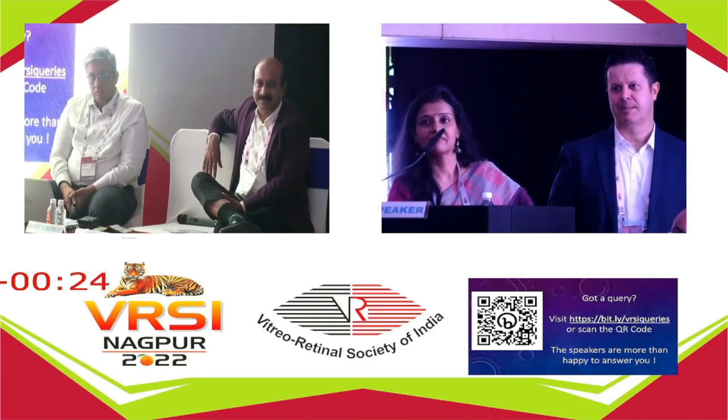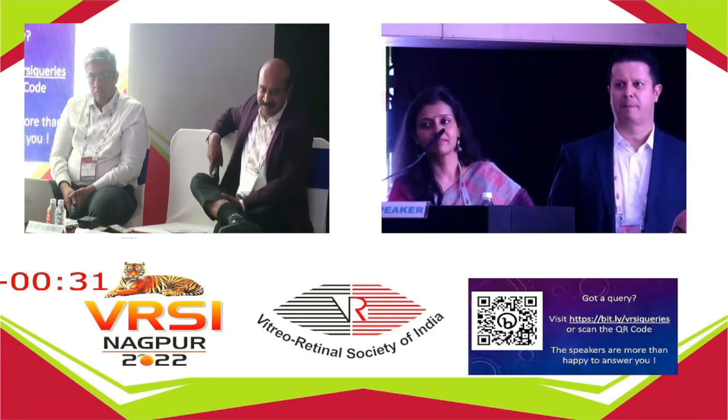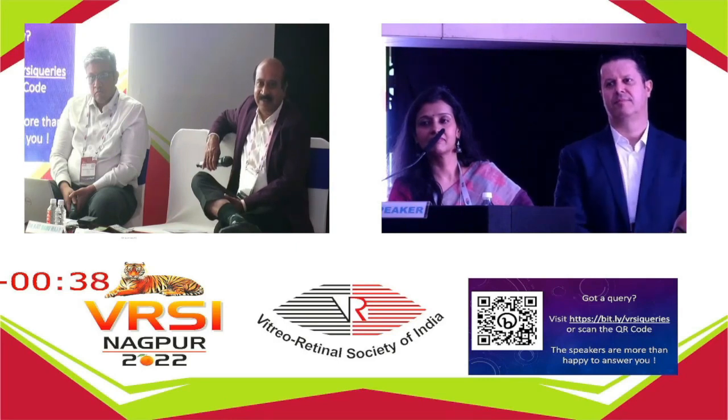But overall, I would say that if you want better contrast for fundus imaging, confocality matters. All of the confocal methods are going to give you a better picture in the setting of media opacity. I know I made a point of it in the other talk, but we have to think about media opacity and some of the real issues when we're actually obtaining imaging in a patient.